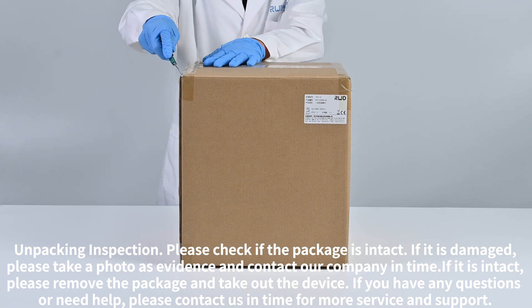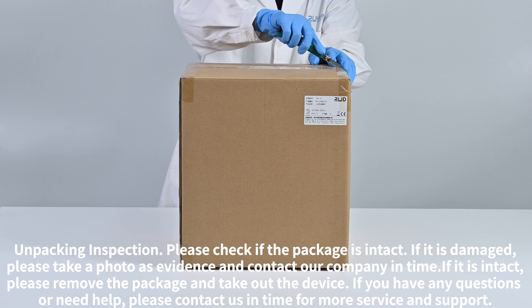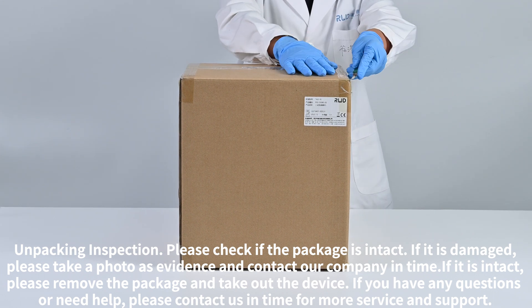If it is intact, please remove the package and take out the device. If you have any questions or need help, please contact us in time for more service and support.